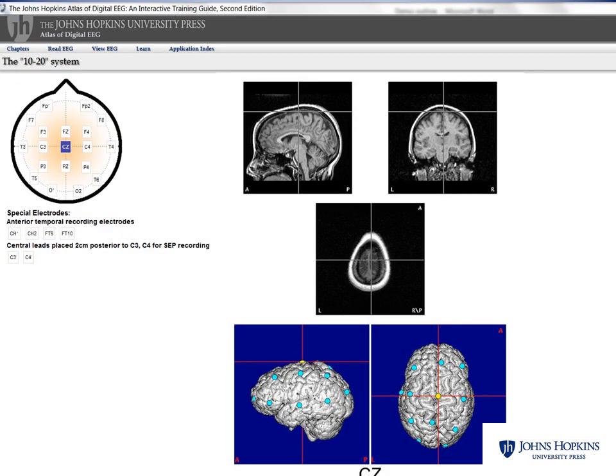The atlas includes a three-dimensional MRI depiction of the 10-20 system. This interactive feature allows users to click on an electrode icon to view detailed images of its placement.